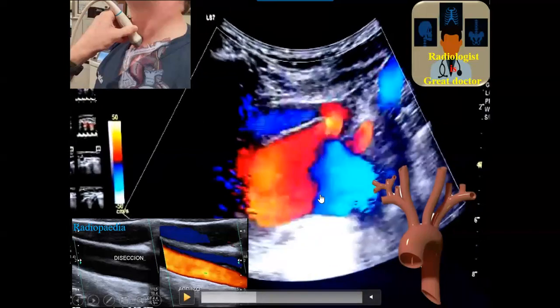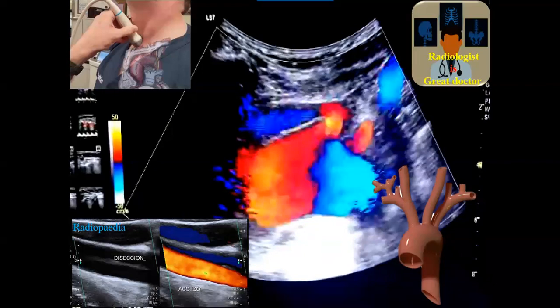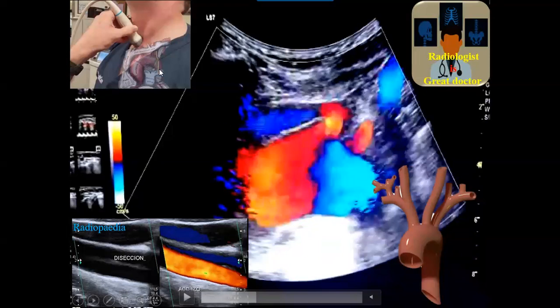Of course, this is artifact because the transducer beam is now at 90 degrees. Alhamdulillah, no intimal flap can be seen in the aortic arch. So if dissection is seen, it may be primary and not secondary. What you would recommend next if you suspect dissection is CTA. This is a simple approach to rule out whether it is secondary or accompanied by aortic arch dissection. Thank you.